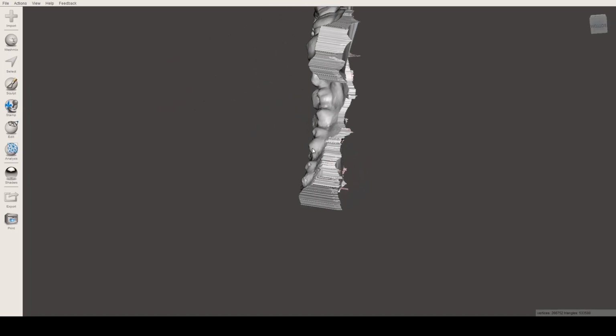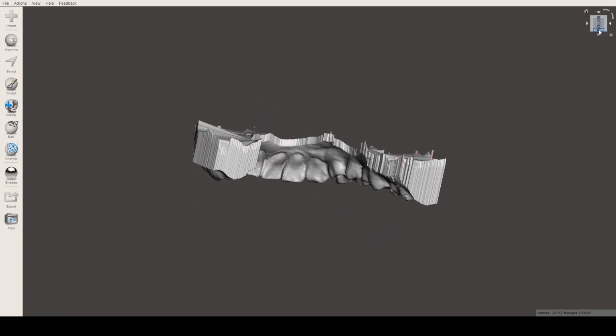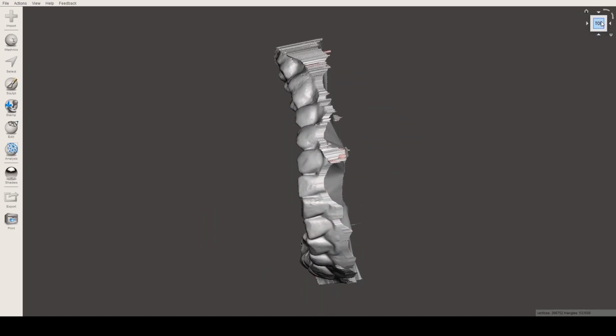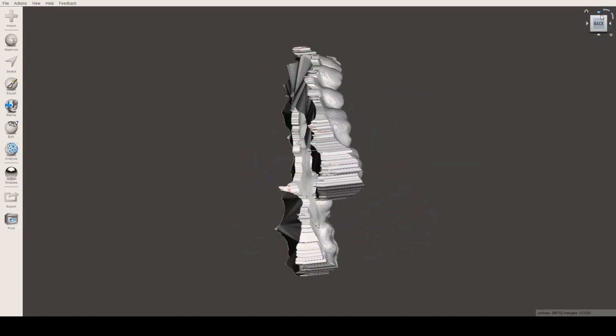You can also, if you want, move around the 3D model by using this navigation square, or no, not navigation cube, on the top right corner of your screen. As you can see here, it shows you the points of the cube: left, right, back, front, top, and bottom. So you can move it around, you can explore with that, you can play with that.